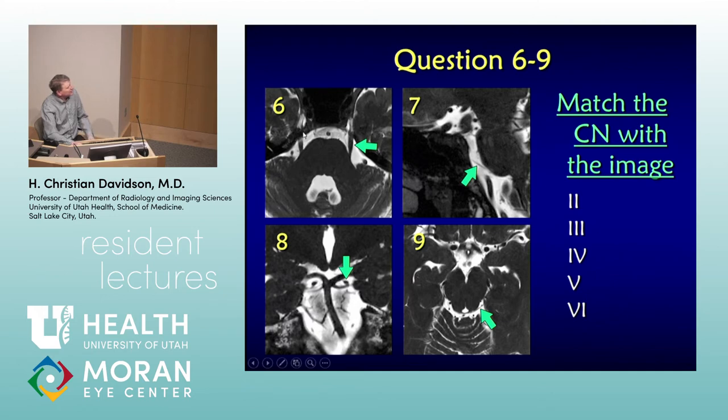These two, on almost any sequence, these are normal findings. And one of the things that we look for is maybe a meningioma or a schwannoma that's occupying 5 and Meckel's cave. When Meckel's cave is missing, you'll hear us use the term a winking Meckel's cave because it's missing on one side. But that's a structure that's very reliably seen associated with the five.